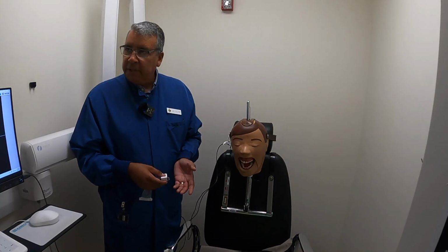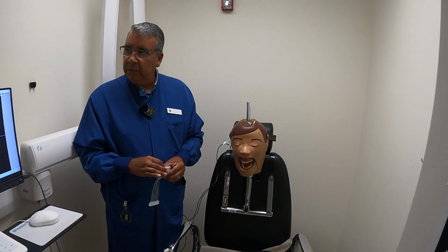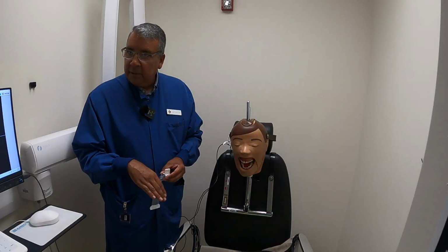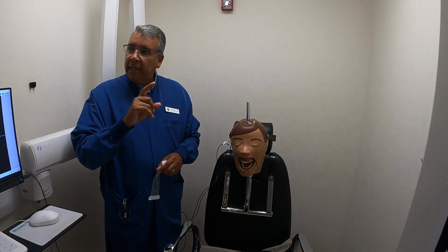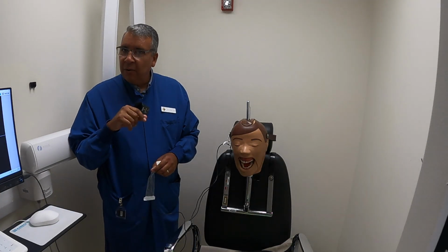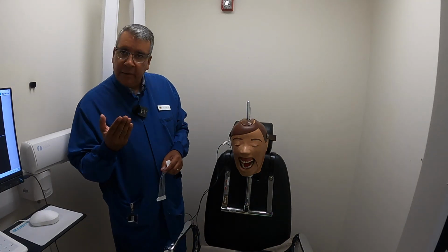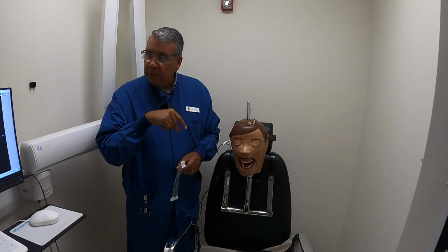And then I'm going to have you guys help me out a little bit with this. We're taking a premolar picture, right? So what tooth do we need to include in this picture? The canine. From the maxillary or from the mandibular? Oh, which one are we referencing? The upper canine or the lower canine? Only one. The lower. In a normal bite, we are just doing the lower. Why? Because that lower canine in the normal bite is more anterior. It's more forward. And if you only reference the upper one, we'll lose the lower.